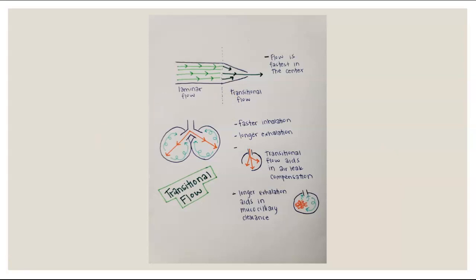So that covers the theory portion of how the jet works and why we would choose it. Next, we're going to go into the components of the high-frequency jet ventilator.